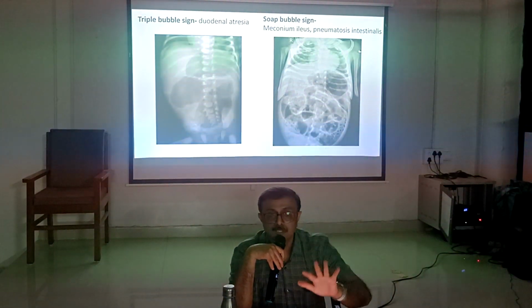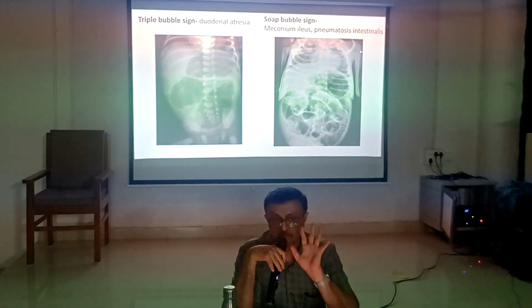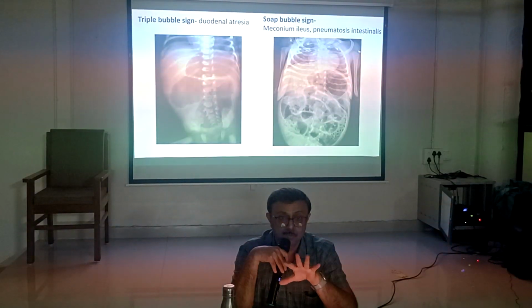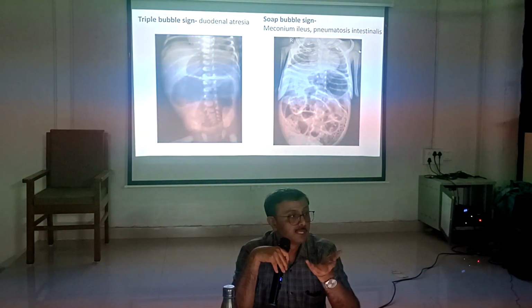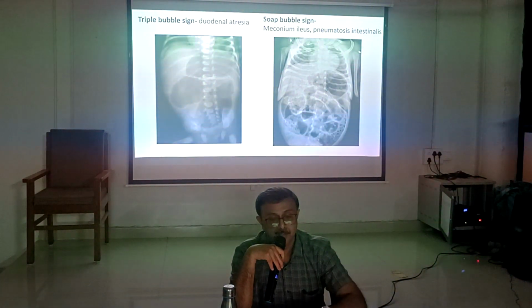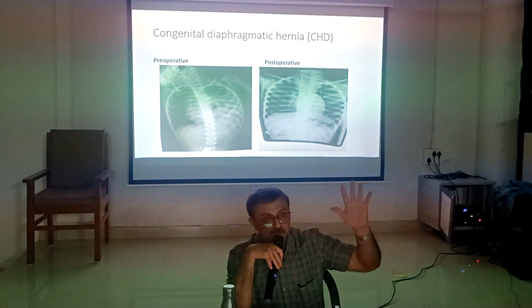So that you can see the sign. In adults pneumatosis intestinalis is very rare. In pediatric patients it is not uncommon. Toxic megacolon and necrotizing enterocolitis are not uncommon. Growth is different in a child.